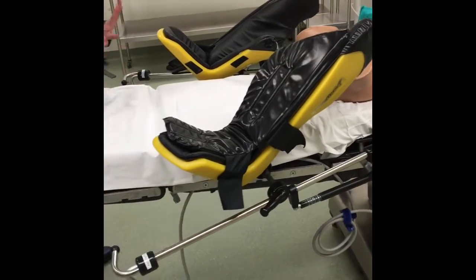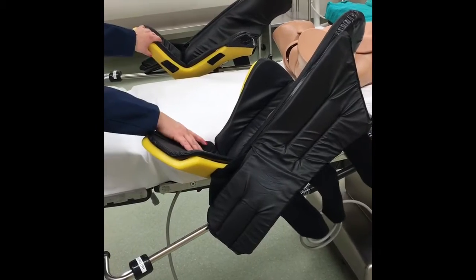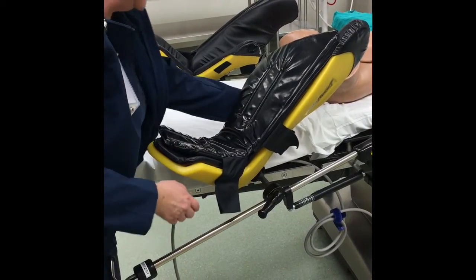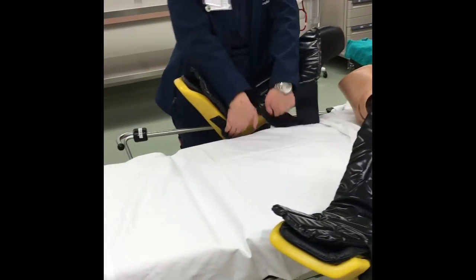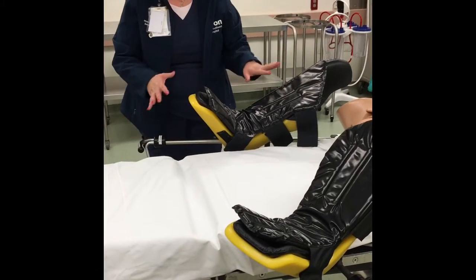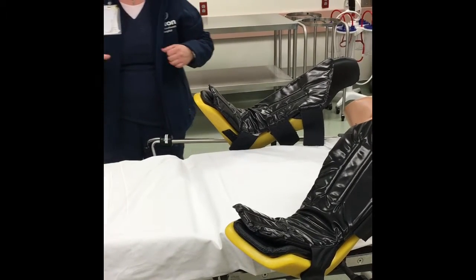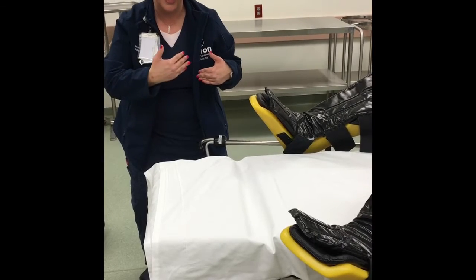Whenever the patient, they'll be asleep by this point, so you'll want to now put their legs into the stirrups. You'll put each one in, and then close this section all the way around. Do the same with the other. To get them in the proper position, once their legs are up, you're gonna want the inside of their thigh to be soft. So you're gonna wanna really treat them like you're matching the shoulders with the leg.